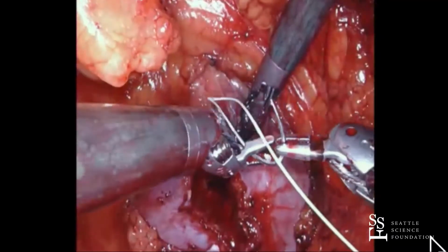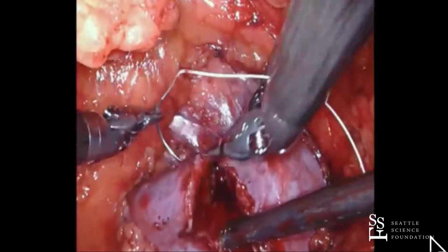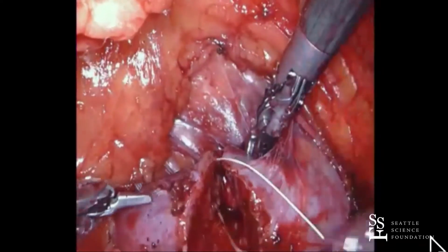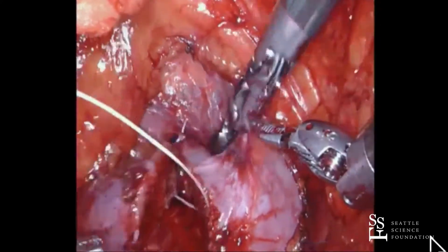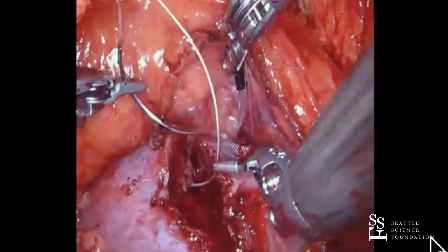So obviously when you have a defect like this, you don't want to start here, you want to start on the back side, because this is going to be the hardest stitch. If you close the front, then you're going to have problems. And notice I'm going to close this from left to right, and that's on purpose. The reason for that is that my assistant is going to try and place Hemolox for me.